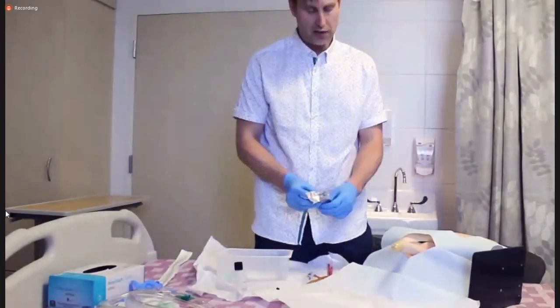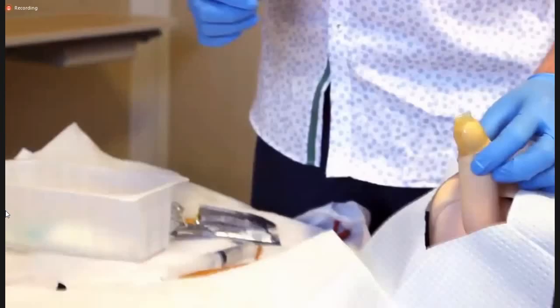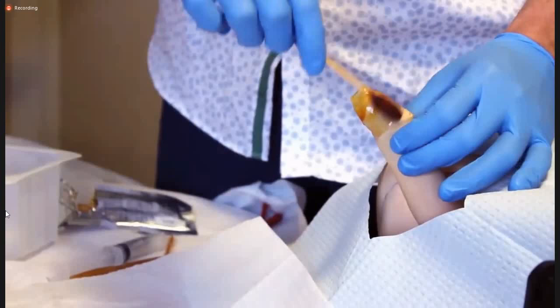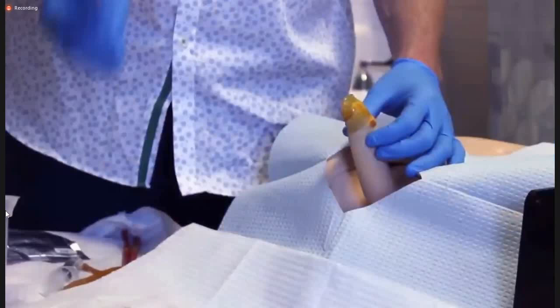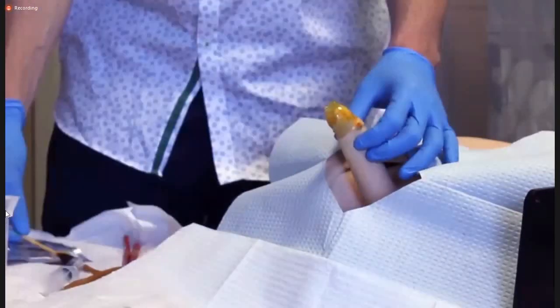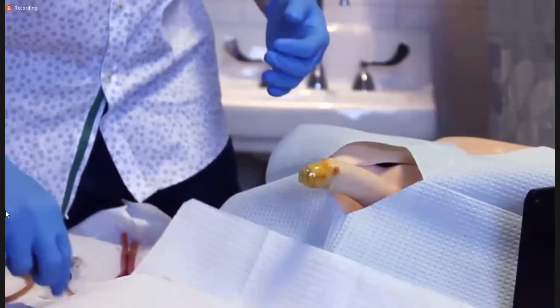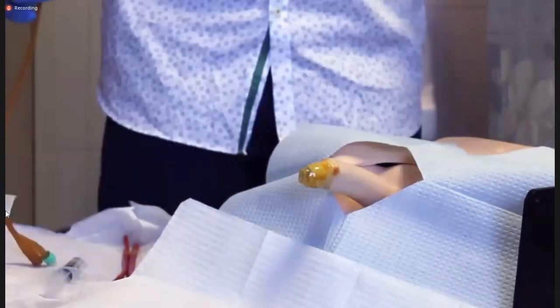Once you've established your sterile field, you can do this either before or after, we'll obtain our swabs. And what we will do is then, with one hand, which is now a little bit contaminated, take the swab with the other, and we'll dab it around the urethral opening and the rest of the penis. Now, you don't have to sterilize the whole area, but obviously the part that you will be placing the catheter through. Once you've done this, usually 2 or 3 times, you can place your swabs to the side, and then you can simply grab your catheter, make sure it's well lubricated with all the lubrication that you can get, and then you can start the process of placing the catheter.